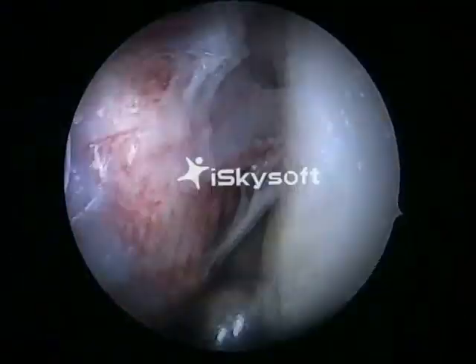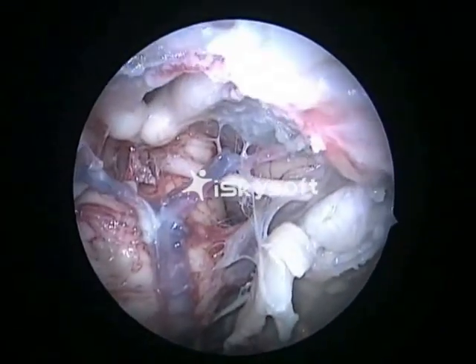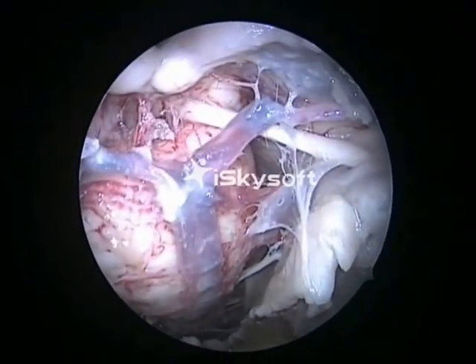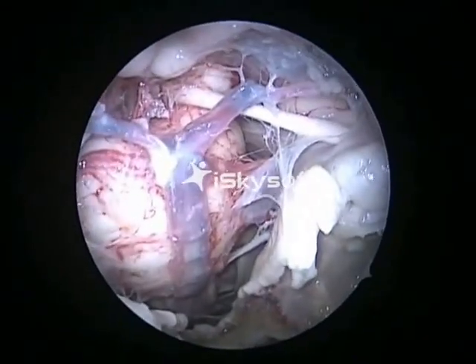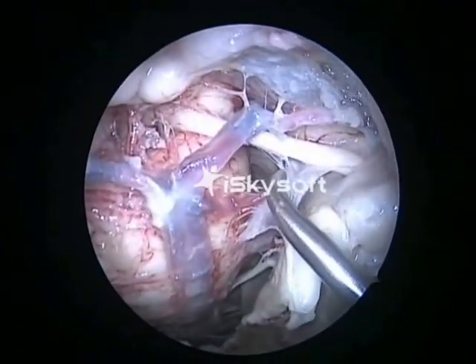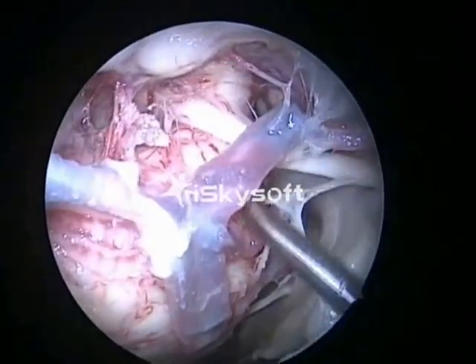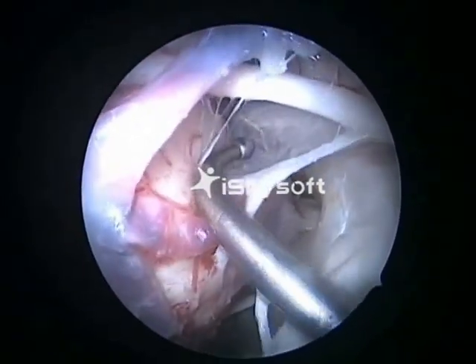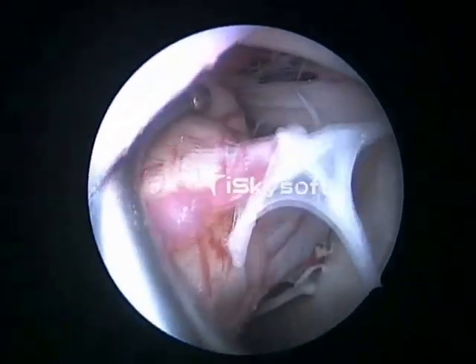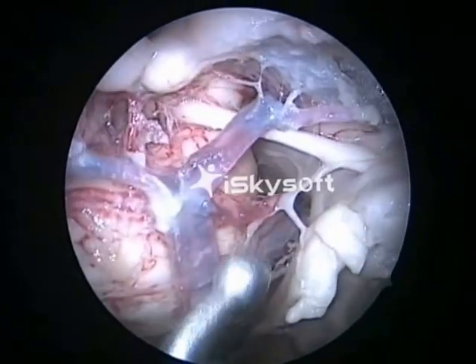That's the third nerve. That's the fourth nerve being dissected. It's a slender nerve coming from the dorsal aspect of the brain.